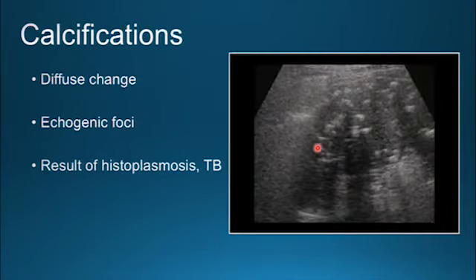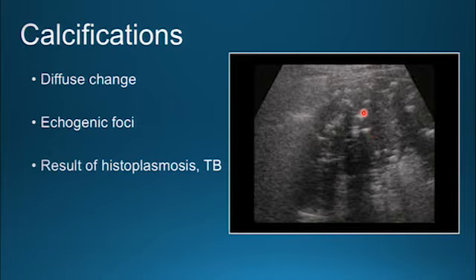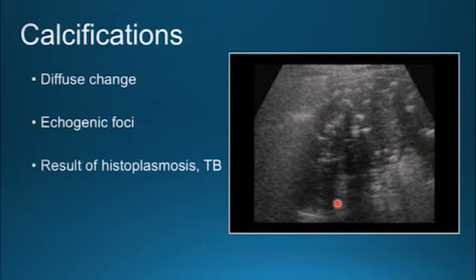Calcifications represent a generally diffuse change seen within the spleen. There are echogenic foci seen all around the spleen — usually diffuse, so you see multiple echogenic foci scattered throughout rather than just one or two. This can be a result of histoplasmosis or tuberculosis, some type of infection.